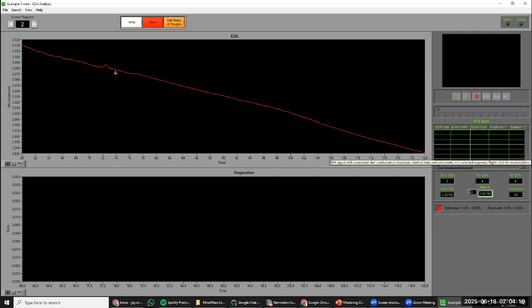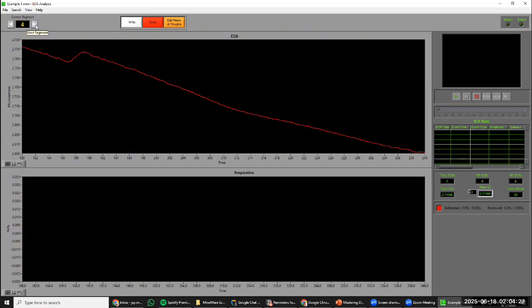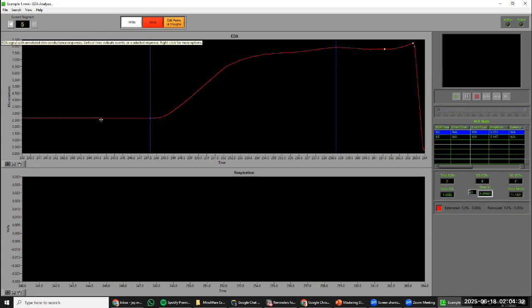And so this sort of straight line going from this second quadrant down to 4 is typical in those cases. It's not something where the data are bad. It just can occur in some participants. So for this person, they're just chilling out, not having a lot of that phasic or sympathetic activation. And then all of a sudden we do see some change here. So anyways, it's something to be aware of that's not super common, but it can happen in those different components of your study.